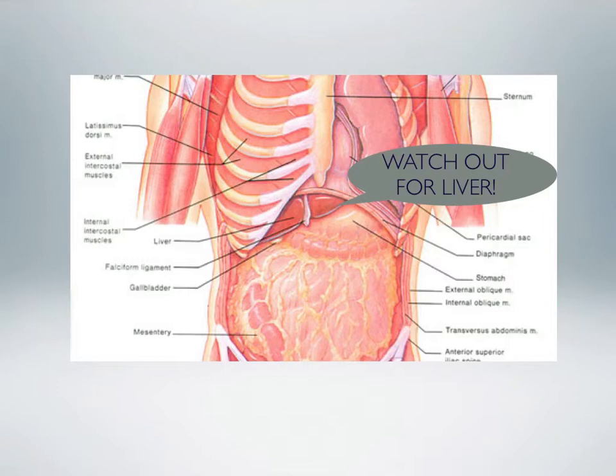If I had somebody in DIC, or somebody who was on Coumadin and you were afraid they bled into their heart, someone who has a bleeding diathesis, I would probably go parasternal. But the information on that, in my opinion, is purely anecdotal. I don't know of any major reports showing complications by going through the liver.